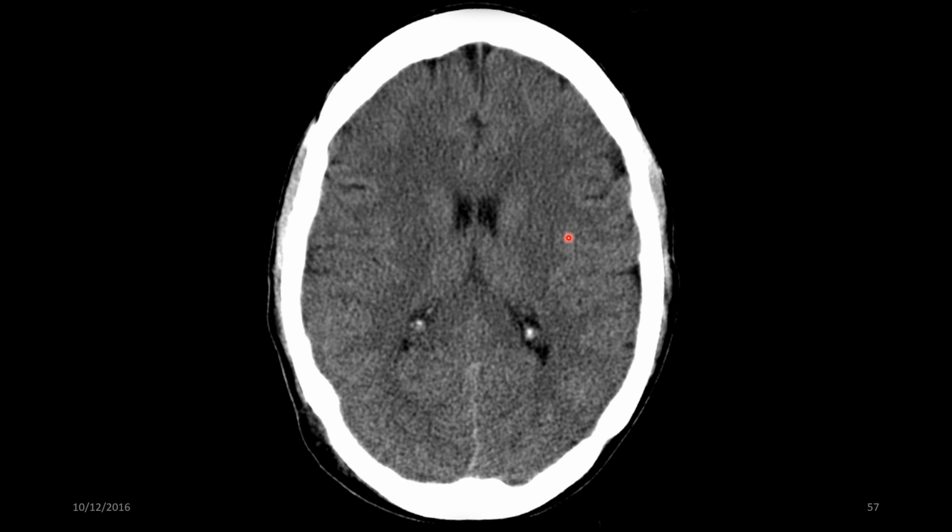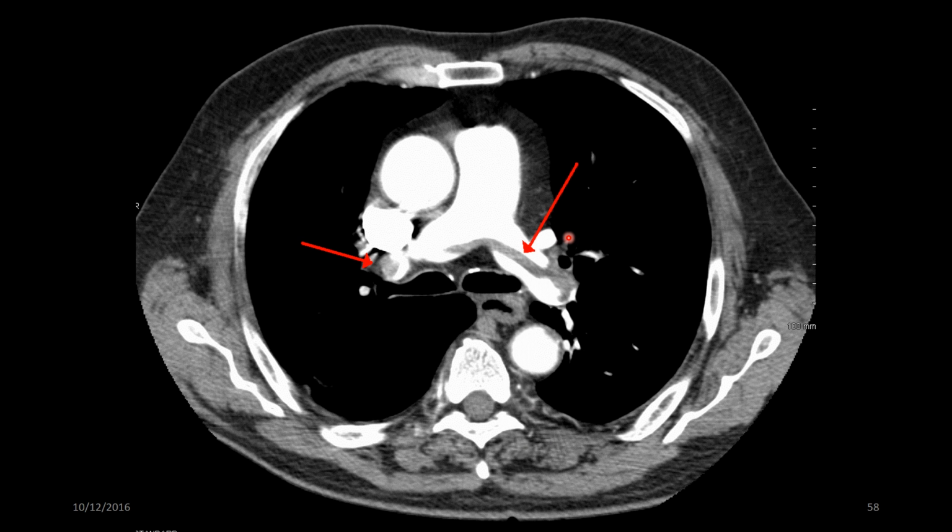And anybody that has a head injury now or a stroke can have a CT head scan. It can tell whether they've had a bleed, an infarct, or skull vault injury, so whether they've actually got a fracture to the skull. A massive amount of information. You can give contrast to look at vasculature, lots and lots of things. It's not just used for head imaging. So we're going to move on from head imaging to thorax imaging.